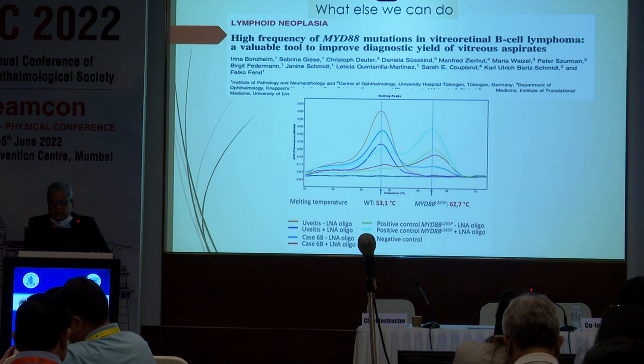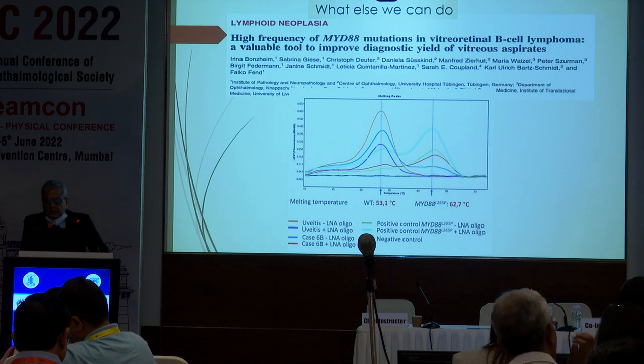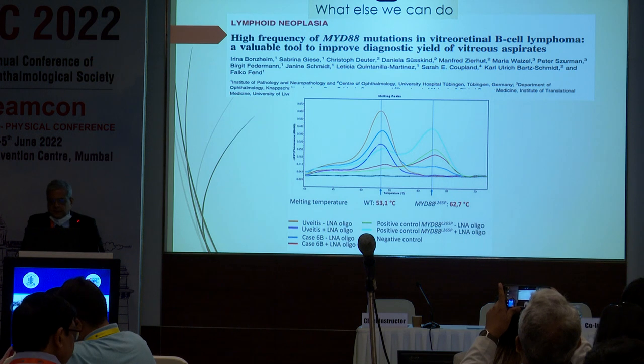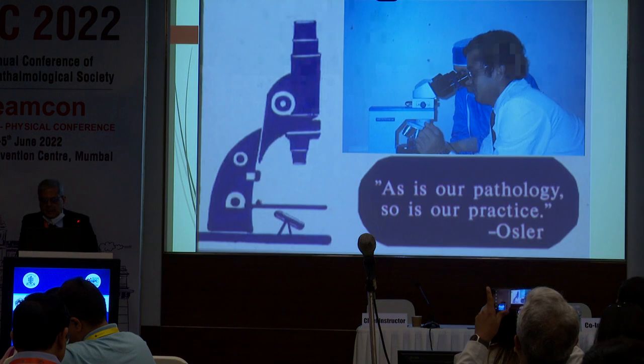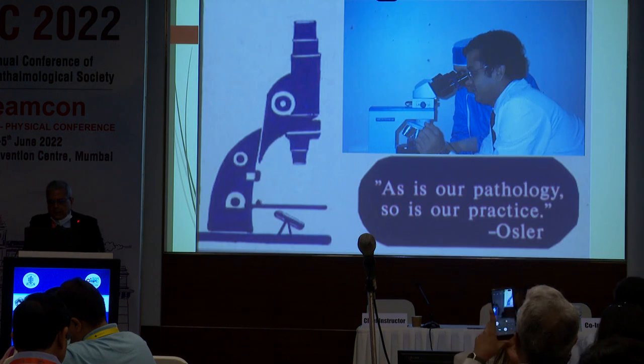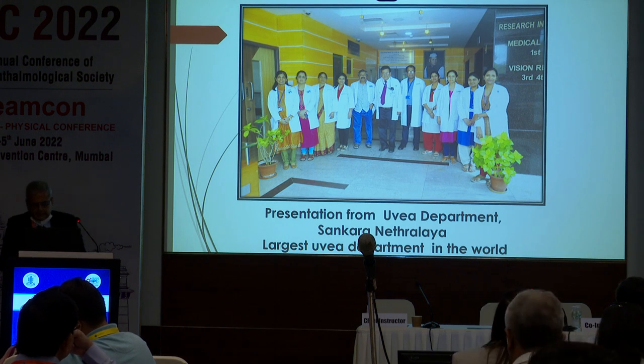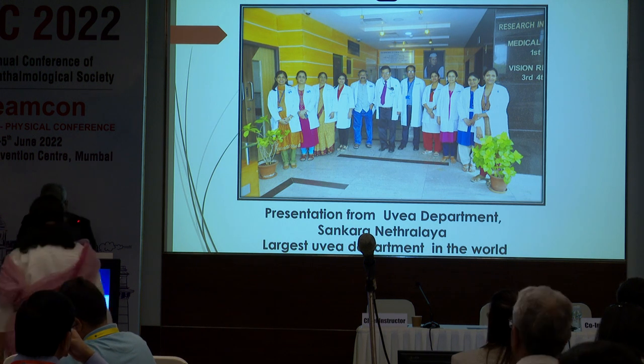Last but not the least, we are doing MYD88 L265P mutation testing, which is useful in vitreoretinal lymphoma, and we can detect the spike in the DNA gene sequencing. And last, I conclude that as is our pathology, so is our practice. Thank you.